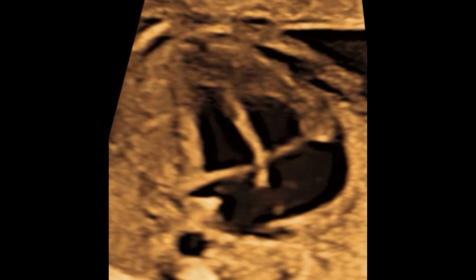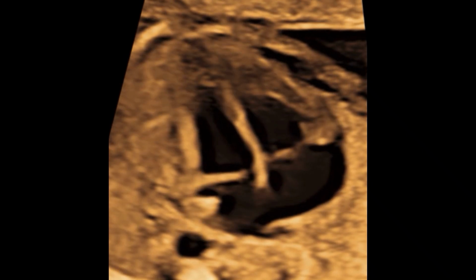Now if you see here, the valve is about to open. So before that, if you see, this is atria, both the atria are in fullest diameter. This is the time when you should measure the atria, and you can see that the ventricle is contracting and in ventricular systole. And next, to measure the ventricle, it should be in diastole.